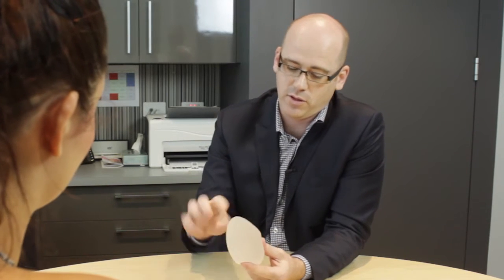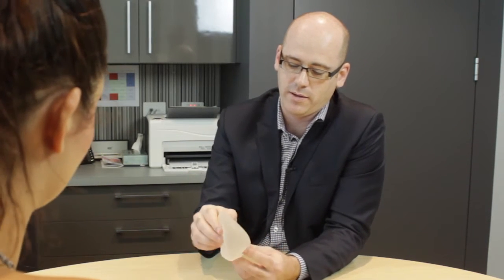Or they can be an anatomical shaped or teardrop type implant where the top's more natural compared to a round one, and there's a lot more volume at the bottom. And with teardrop ones or anatomical implants, we can adjust the width, the height and the projection differently, so we have a bit more variability with a teardrop implant.